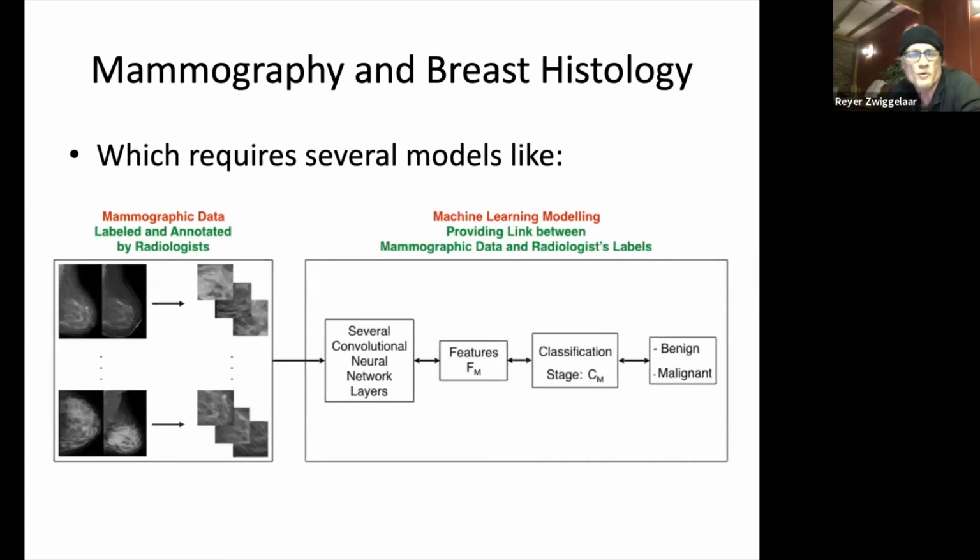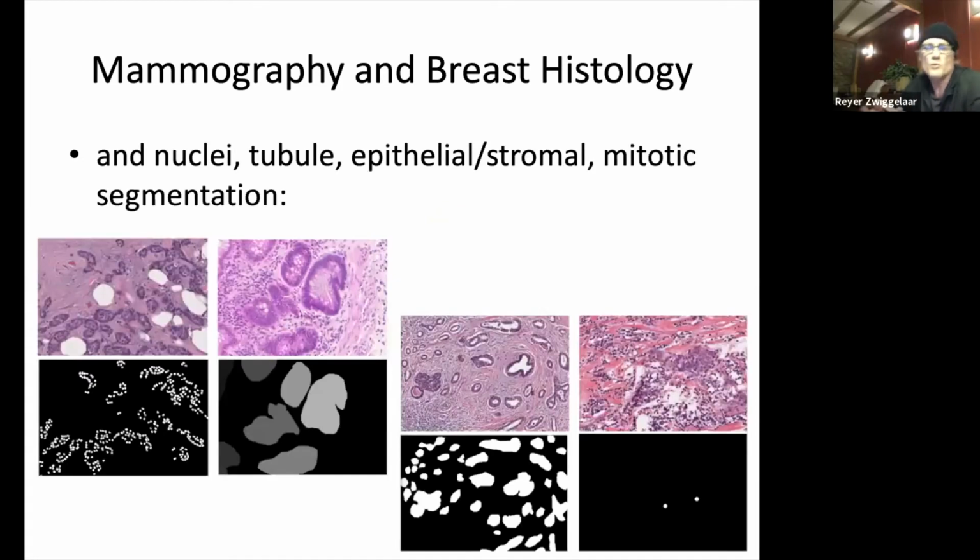So effectively, we've got a deep learning approach where we put images and regions of interest in. Then the deep learning network extracts features, and uses those for classification into benign and malignant. And that would give us one model in our overall scheme. This work is ongoing, as I said before. We did some initial work, which comes very close to what we want to do, but that needed some pre-processing of data and a slightly different approach to it all.